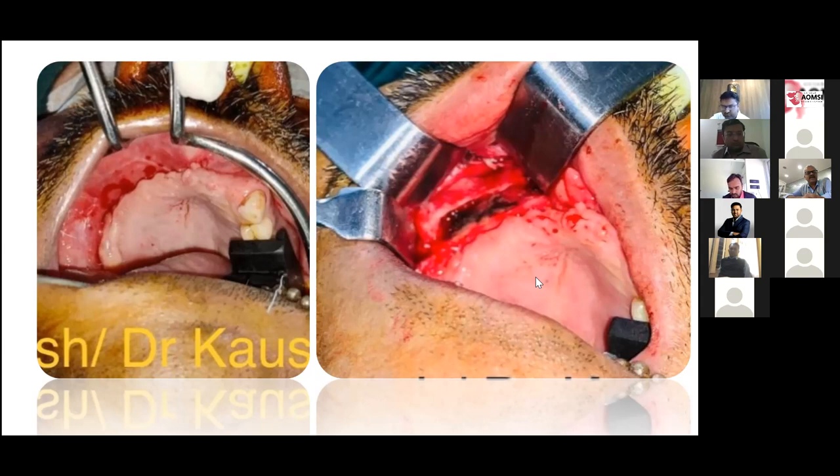Okay, right. So one more question I would like to add here is that, suppose what we have used is the dual zygoma. Now, as Dr. Haren sir well said, whenever we are using the zygoma, it has to be counter-supported from the opposite side. Now, on the opposite side, as we know, anterior to this canine we do not have any good bone to place an implant.